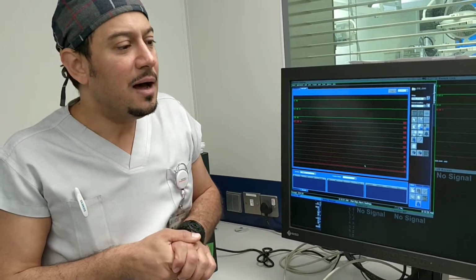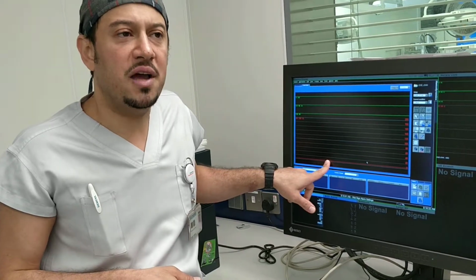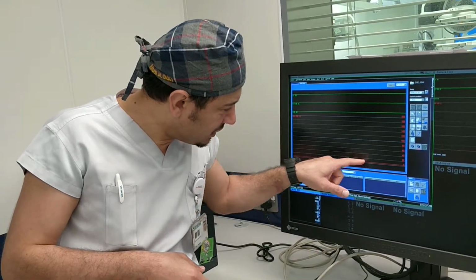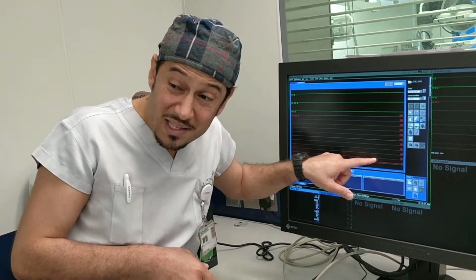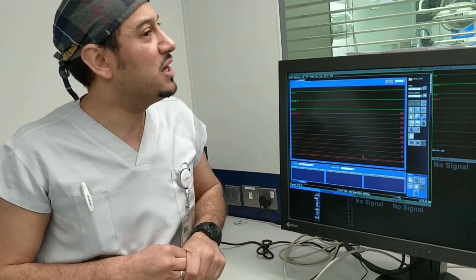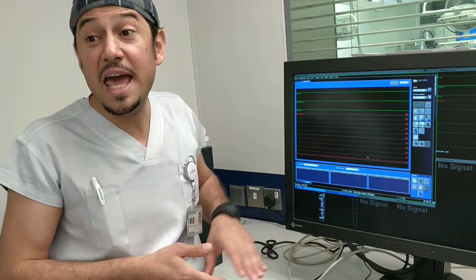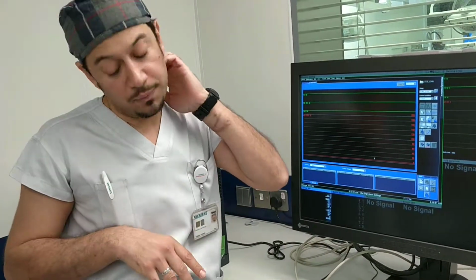Okay. If I put 200 and the patient's RA pressure is 5, what's going to happen? It's going to be a very tiny line here, very tiny line. Why? Because this is 0 to 200, and 5 is extremely small. So the doctor cannot analyze pressure. So what do you do? Change the scale. Very good. Change your scale. Allow it to become big. Allow the doctor to see.